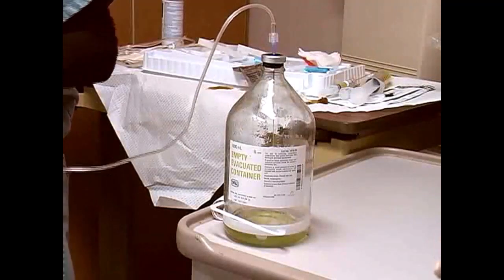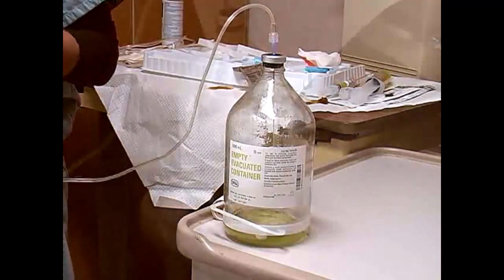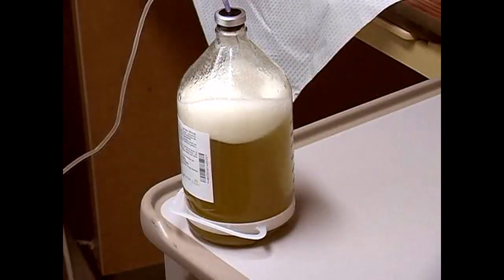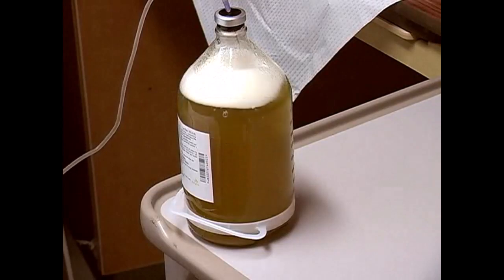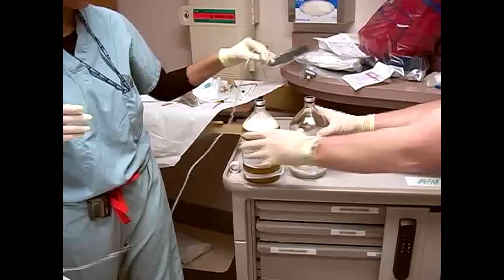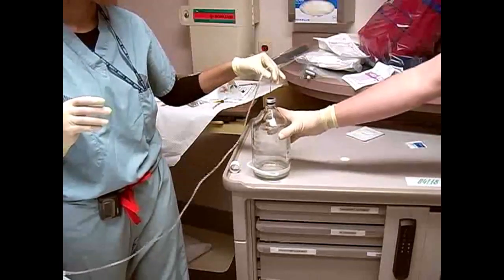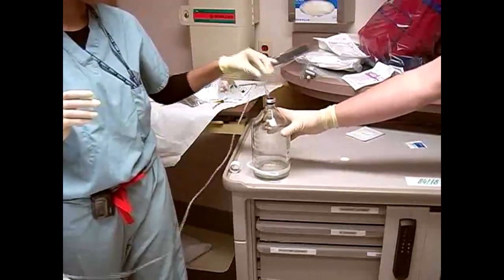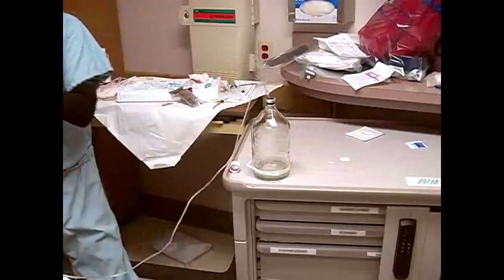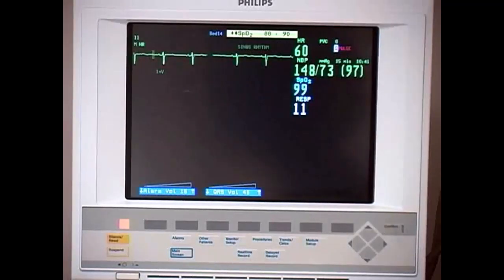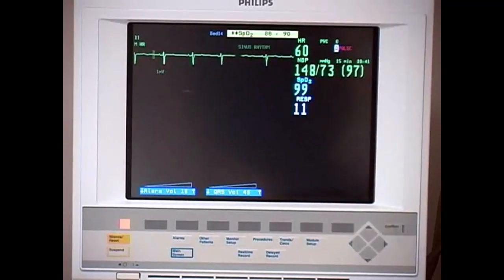The vacuum in the container will actively drain the ascitic fluid. It will take several minutes for each bottle to fill. Enlist the help of an assistant to change bottles during the drainage procedure.